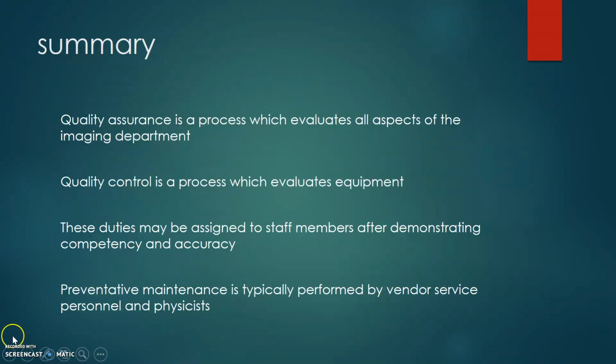In summary, quality assurance is a process which evaluates all aspects of the imaging department. Quality control is a process which only evaluates the equipment. These duties may be assigned to staff members after demonstrating competency and accuracy. Preventative maintenance is typically performed by vendor service personnel and physicists.